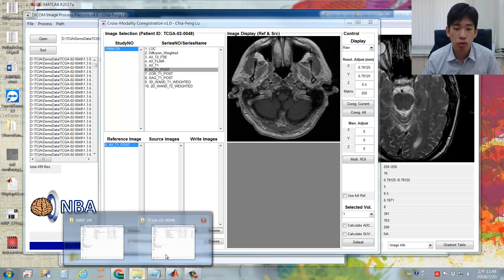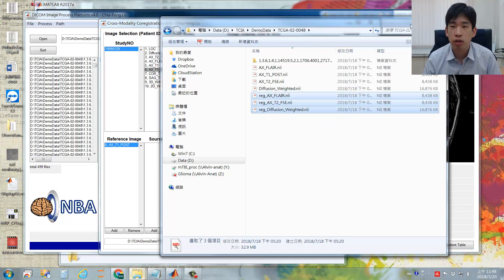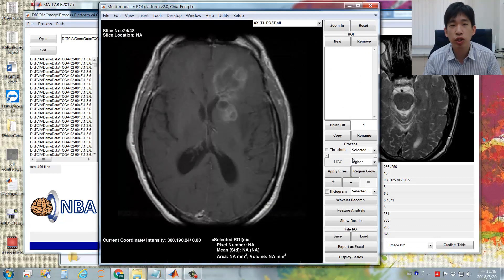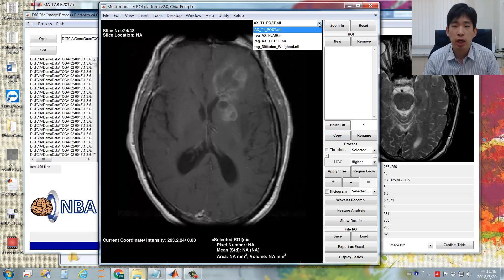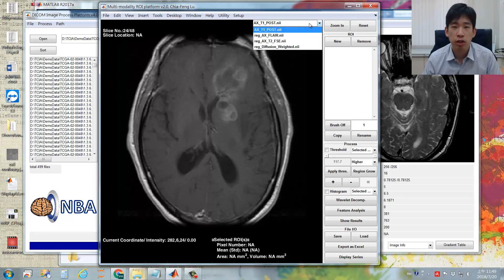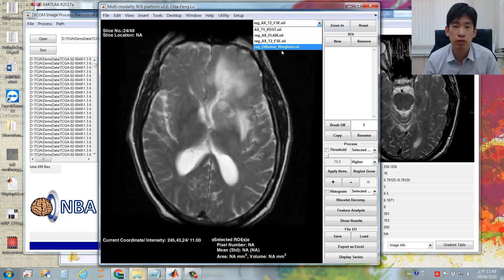If you are sure that all the co-registered images are in the subject folder, you don't need to perform the image co-registration again. Simply click the Multi-ROI button, and a new window will pop up. It will automatically import all the images for which you have already done the image co-registration. You can see the original reference imaging and the co-registered T2 image. Simply click or select different items in the pop-up menu to switch to a different image contrast.